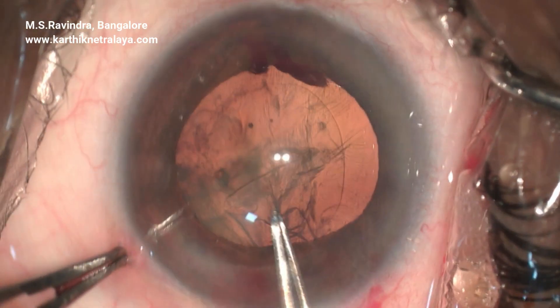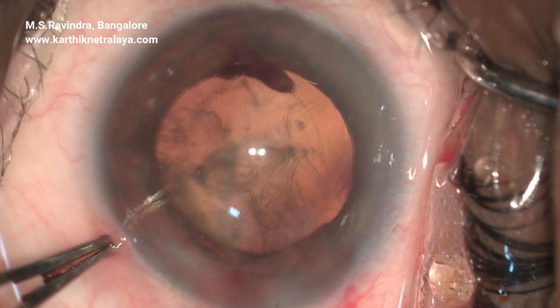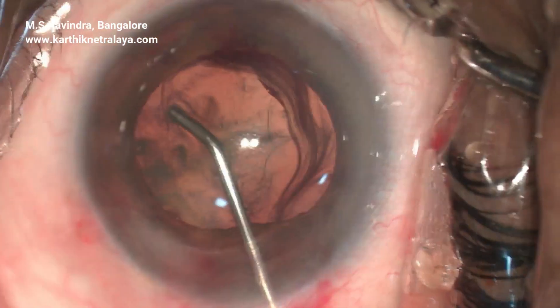You also see an upthrust and pinpoint bleeding from the angle region.